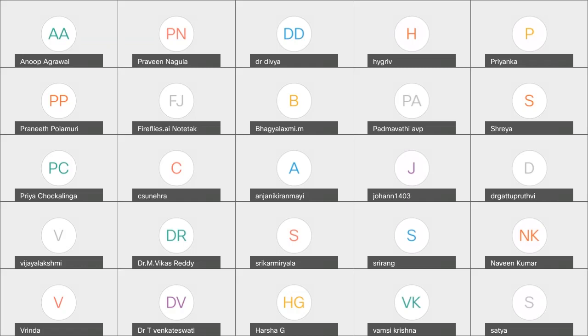So where was the scarring? Only in the apex or throughout the LV? Basal, mid-septum, and apex. These are the areas mentioned, sir. Not conforming to any coronary territory. It's true, but it is not confined to the apex, right? It is actually going beyond the areas where echo had found a hypertrophy. Am I right? Yes. Yeah.